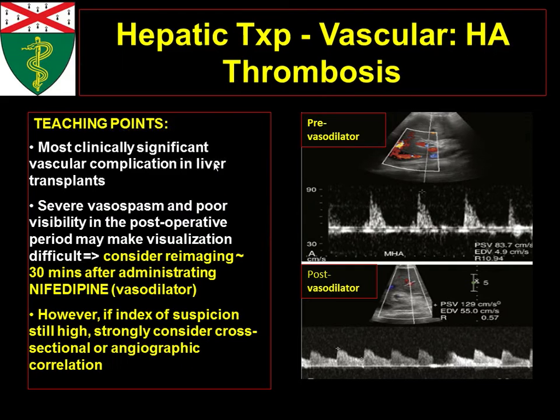So what can end up happening is, particularly in that fresh post-operative period, there may be a lot of edema. There may be a lot of gas around that area, and so you don't actually visualize things well. So one thing that people will ask you to do, and it's not uncommonly done, is that you re-image after giving a vasodilator agent. And they do it up on the floor. It's called nifedipine. And so this is just an example of that.